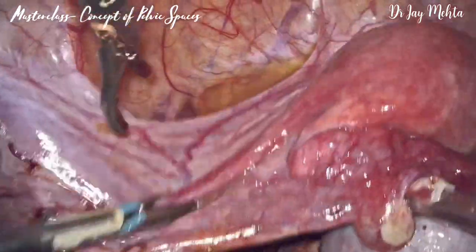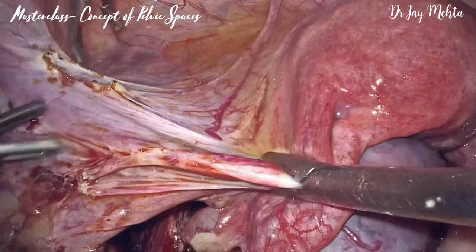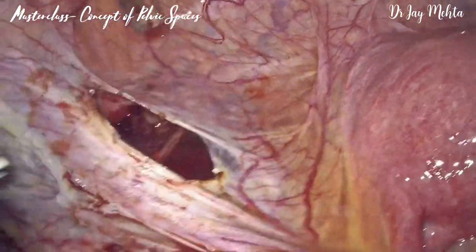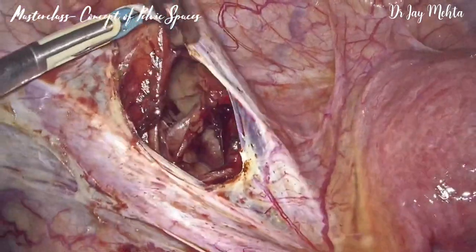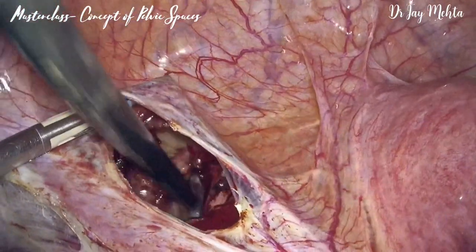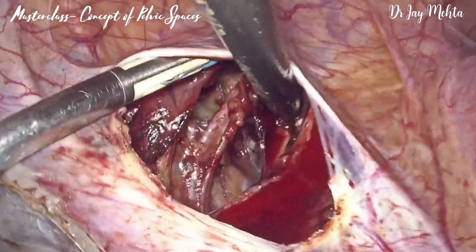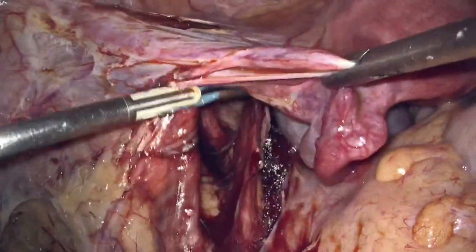We will now try to merge the paravesical space from its anterior approach as well. You can see we are going in front of the round ligament, dissecting open the broad ligament. As soon as the broad ligament gets dissected open, you can see the paravesical space is opened and this paravesical space merges with the pararectal space. You can see the uterine vessels traversing this entire space — the paravesical, the pararectal, and the vascular parametrium — all visible in one standard plane, along with the ureter separating the pararectal space into two separate halves.